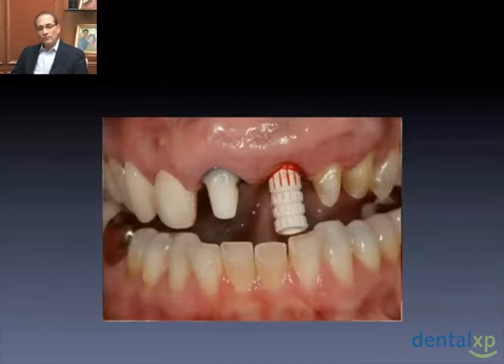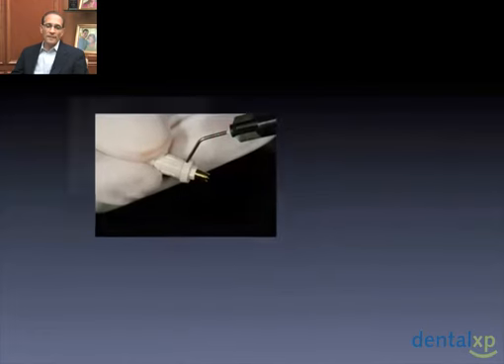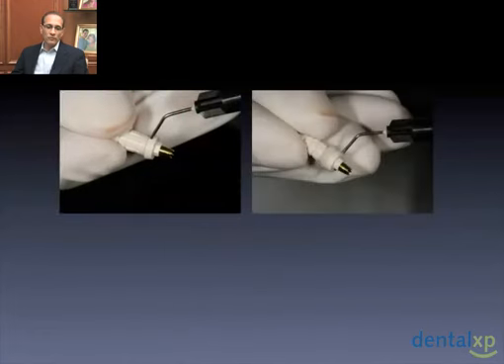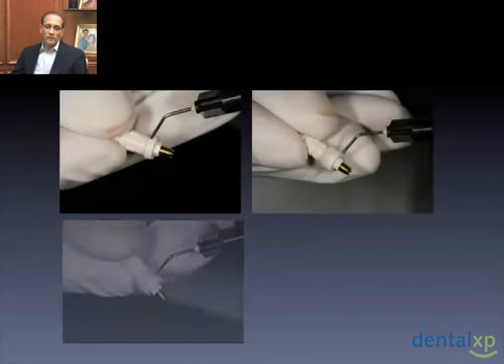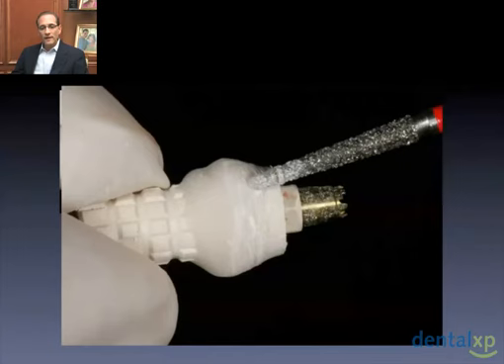We're going to go ahead and place our provisional abutment, and same thing, we're going to remove it, and we're going to start with this case by adding to the subgingival contour and starting to create the subgingival emergence profile of a central incisor. We're going to go ahead and take this back to the mouth.